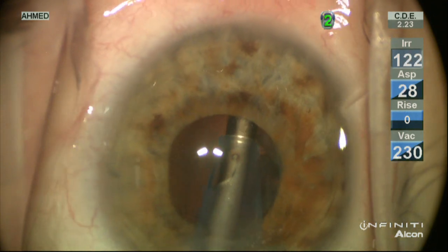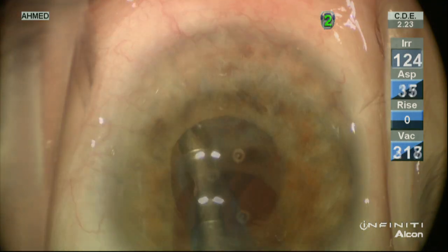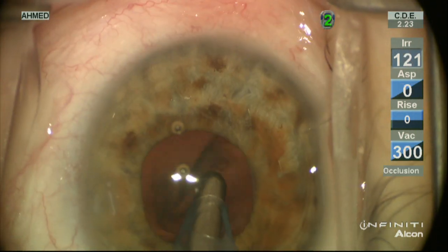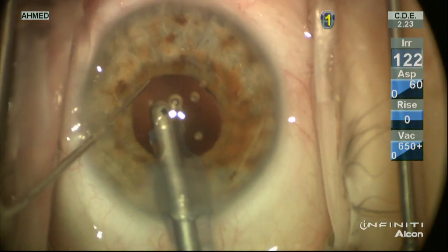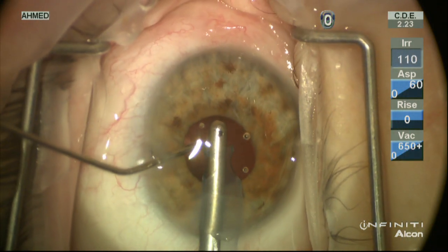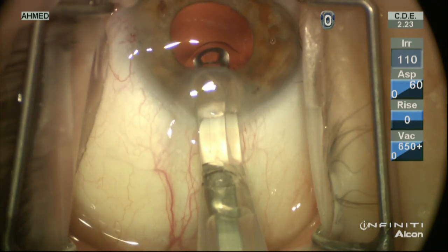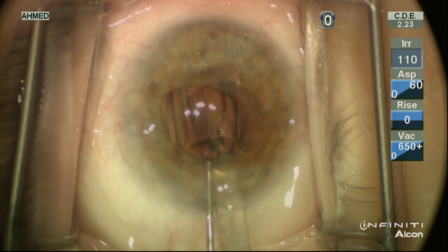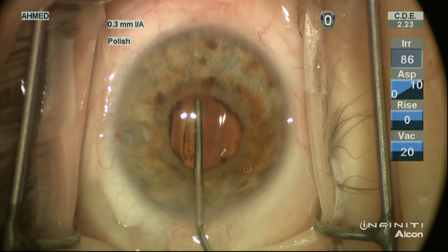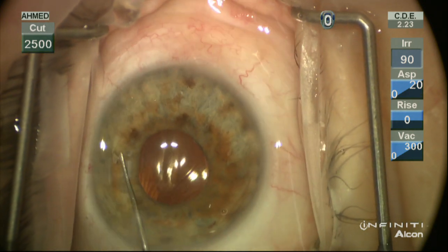The instrumentation really does not need to go beyond the central 3-4 millimeters of the pupillary aperture. We're grasping the central cortical fibers to bring the cortical shell into the central space and remove it efficiently with the IA handpiece. We'll use a Kuglin hook to confirm we've evacuated the capsular bag entirely of cortex, leaving nothing behind. Prior to pulling out, we inject a cohesive viscoelastic to maintain the chamber and expand the capsular bag. Healaflow is injected into the capsular bag — very important to prevent chamber shallowing and risk of intraoperative malignant glaucoma. In these small pupil cases, it's important to confirm haptics are in the capsular bag and that there are no residual nuclear fragments.